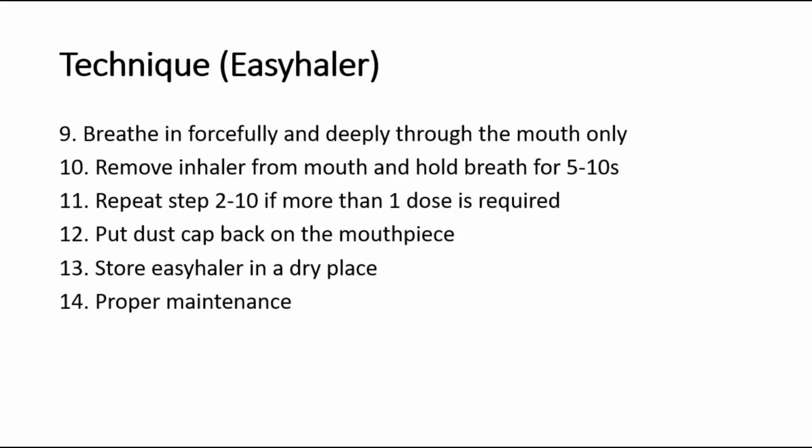And then remove the inhaler from the mouth. Hold their breath for 5 to 10 seconds. And next, if they need another dose or more doses, repeat steps 2 to 10. After that, put the dust cap back on the mouthpiece. And remember to store the Easyhaler in a dry place.